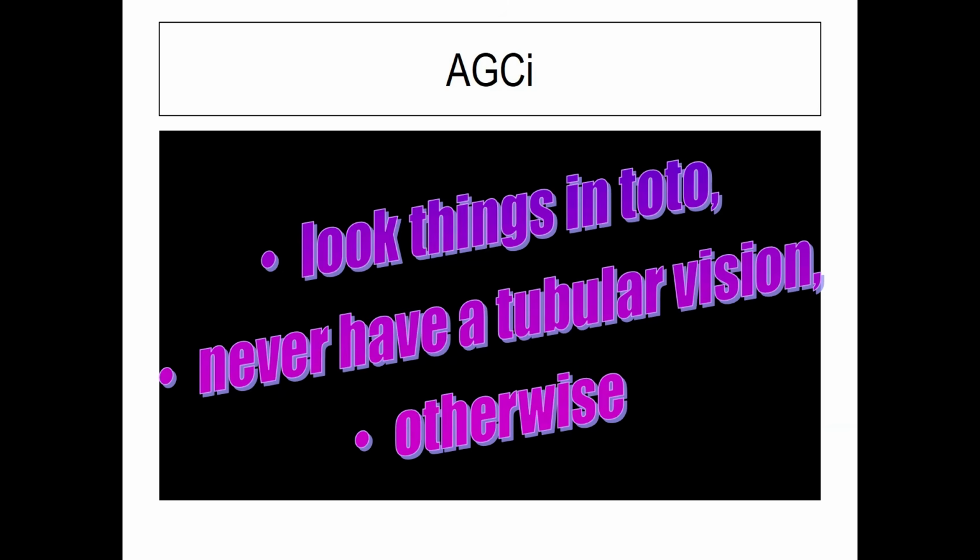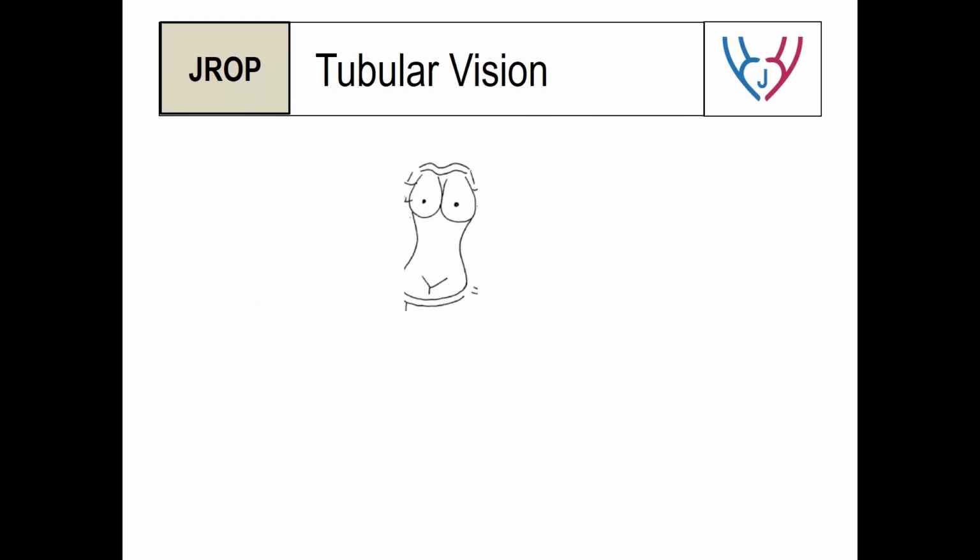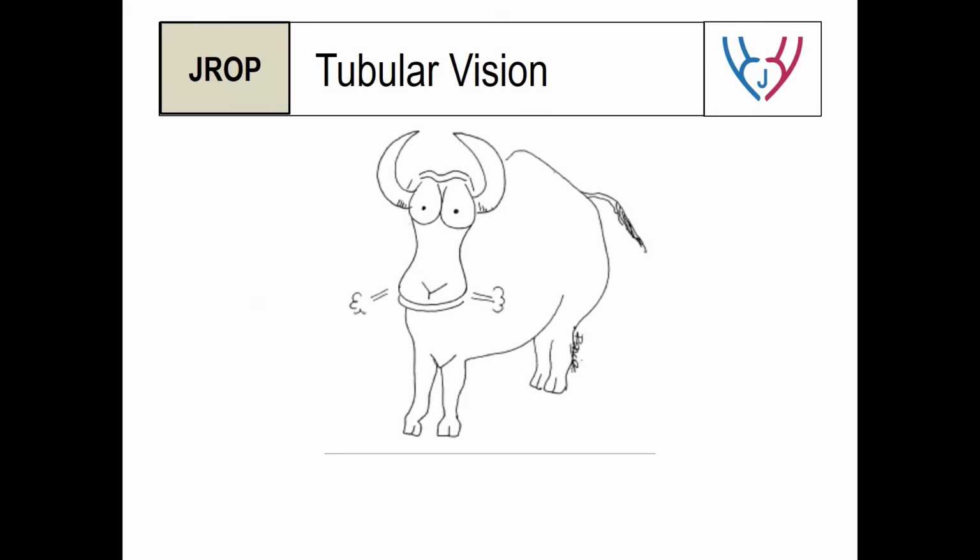I said, when do we do this agitated contrast saline echo? You have to have a vision, like at what time and what vision this slide is. You don't look at an echo just because of this slide. The picture behind this slide is different. So many people have talked about the right heart. Whenever you see RV and RA dilated, just think of it. If you can't find anything, the contrast echo comes in handy.